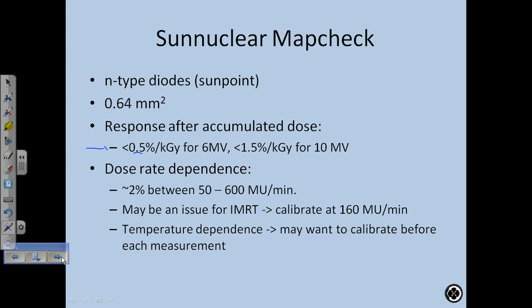Maybe a little more often than that is better. And the calibration, have we done a calibration? Oh, we did it for the profiler. Remember how we set it up, and then we turned it, and we radiated it, and we turned it, and then we shifted it? That's the calibration process that interrelates the response of all of those diodes to each other. That's what they recommend to do a little more frequently than once a year to recalibrate the device.